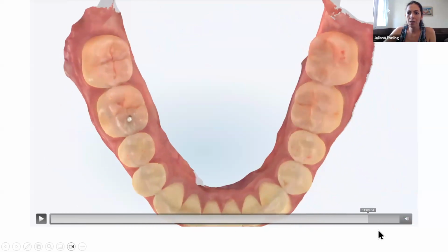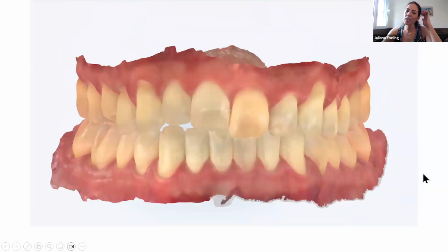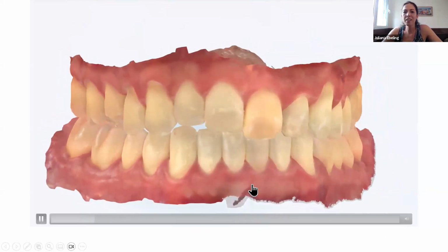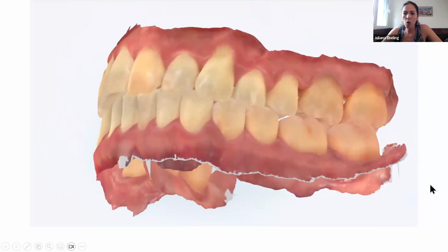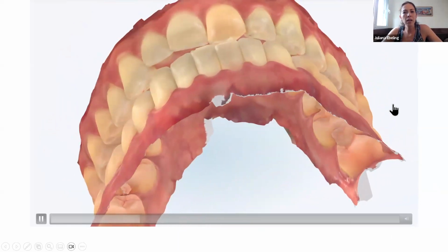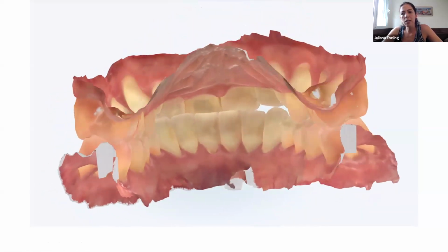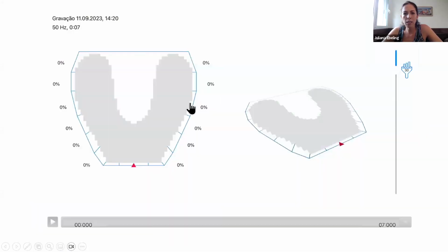So it's an unstable case, and how can an unstable orthodontic treatment stay there? It's not a long-lasting treatment. So we made some additions of composite, recovering the occlusal anatomy, distributing these contacts and getting better contacts.